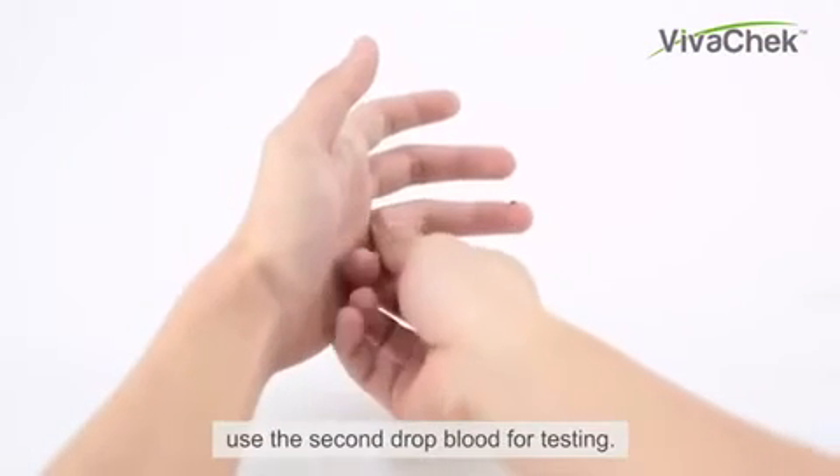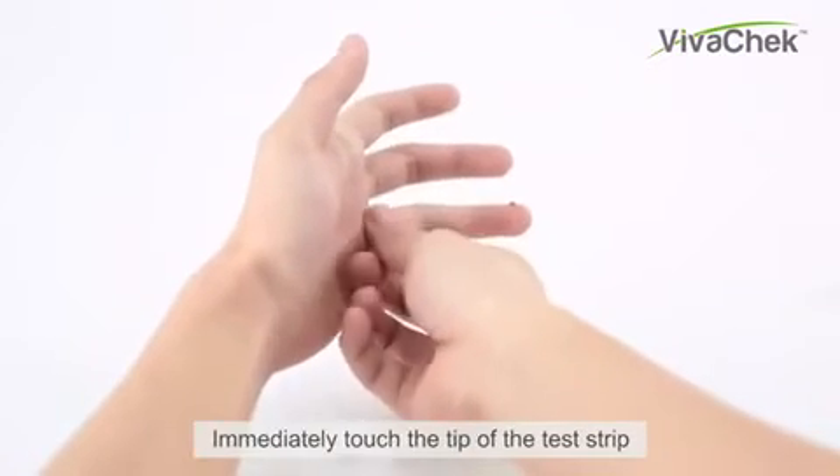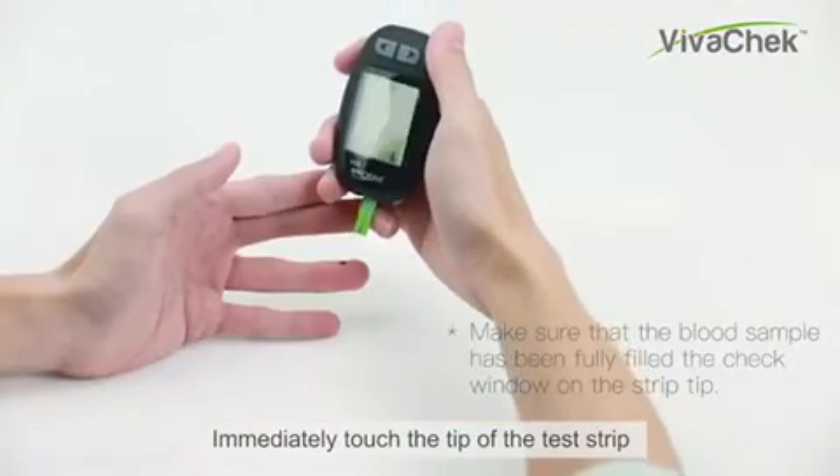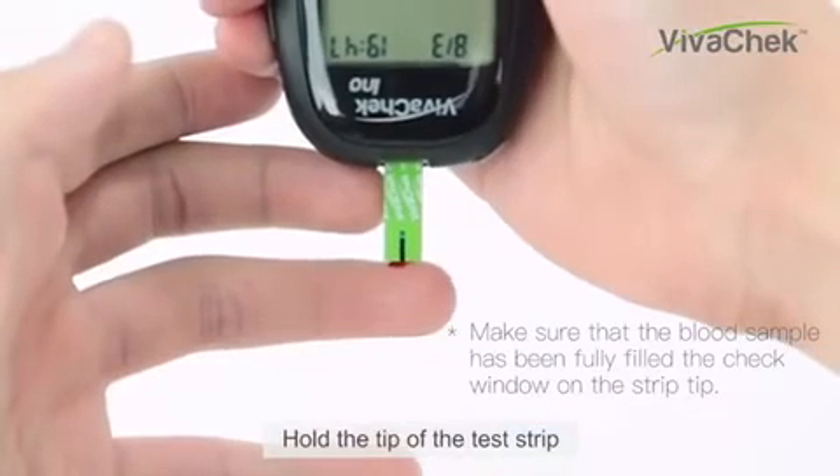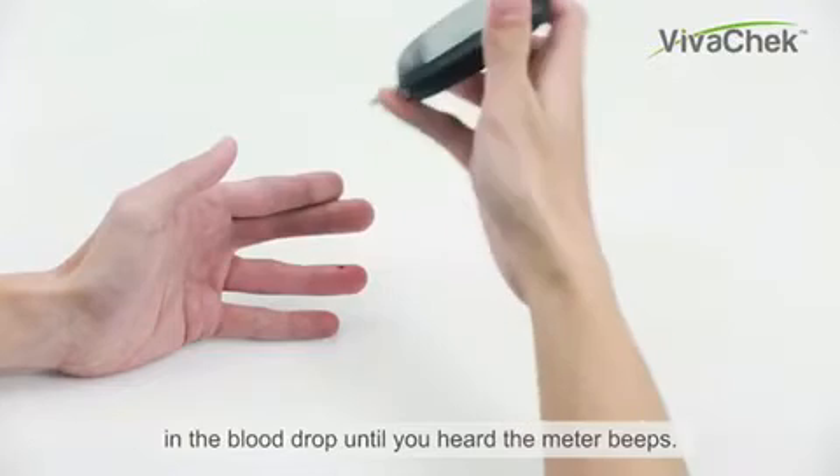Use the second drop of blood for testing. Immediately touch the tip of the test strip to the drop of blood. Hold the tip of the test strip in the blood drop until you hear the meter beep.